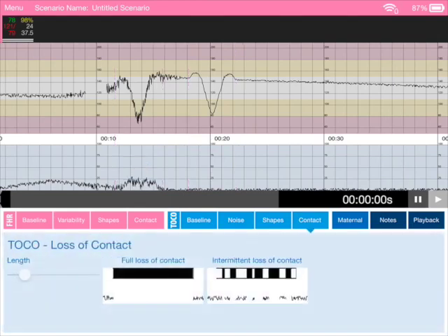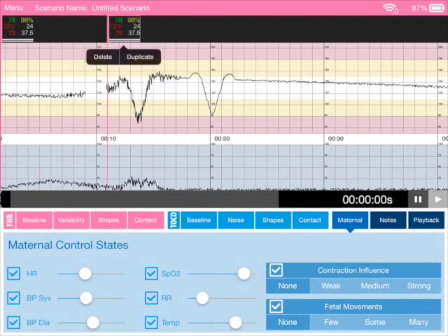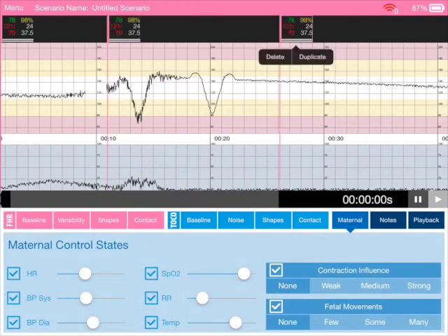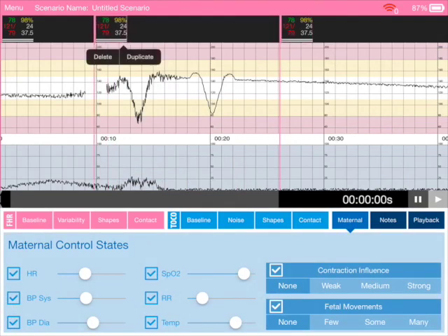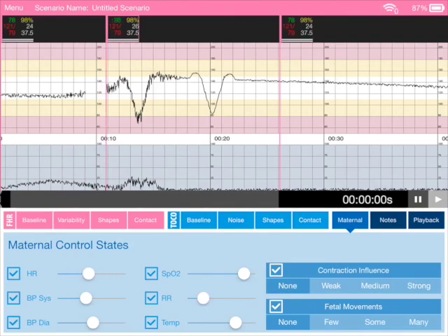The contact is there as well. For maternal parameters, we can add in flags all the way along. We can add a little flag here and we can adjust the maternal heart rate, adjust the respiratory rate, adjust the blood pressure and so on.